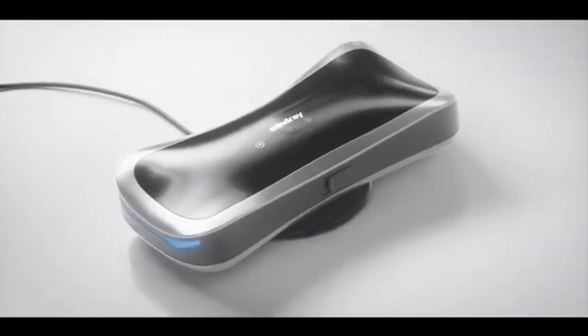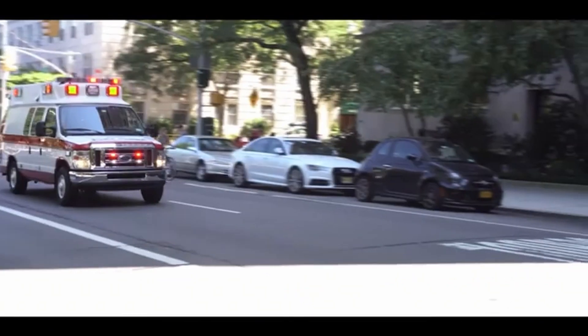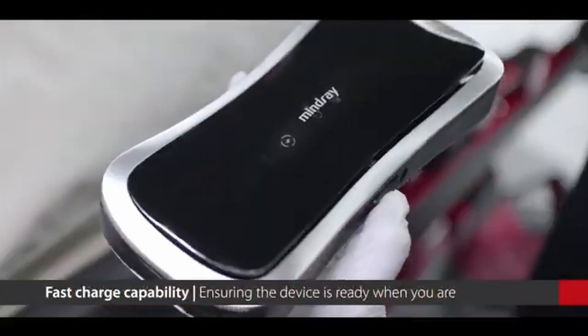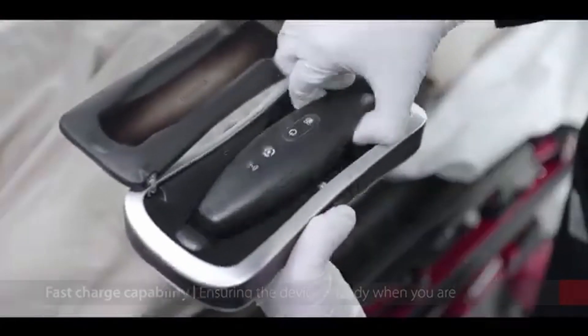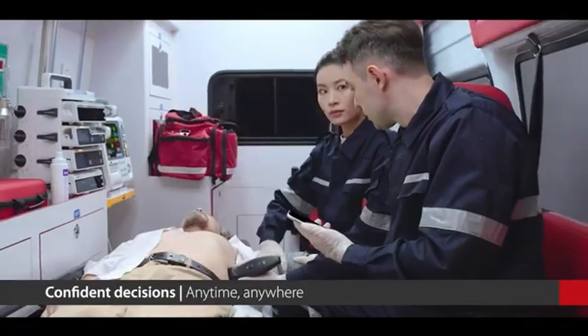Then we have the Mindray TE Air — the heart specialist. This one's focused on cardiac applications with great image quality, so it's like the cardiologist of the group. You wouldn't want to use this for your superficial scans, or they might come out looking like you've aged 100 years — that's what they say at least. Think of it as the meticulous, heart-loving friend in the group, always keeping things on a beat.